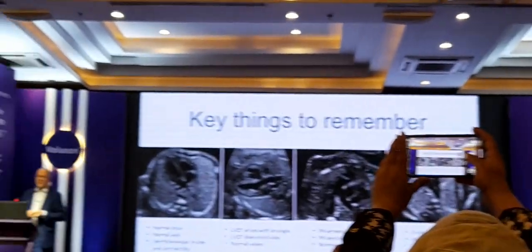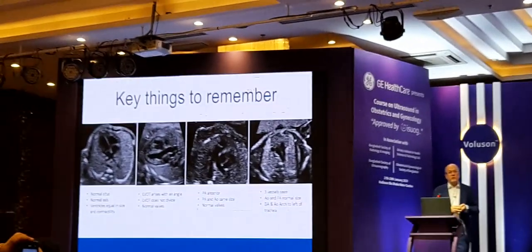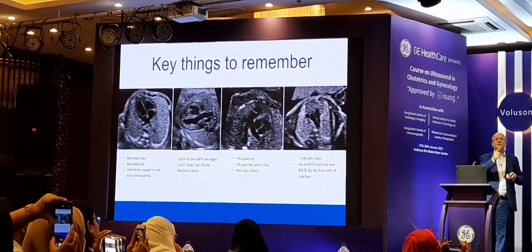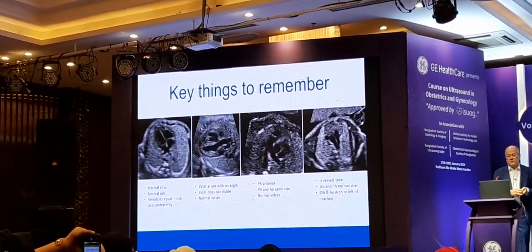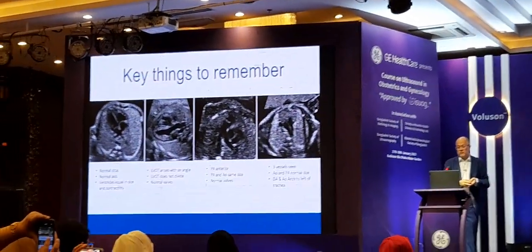And always look at the three vessel view. This is a key view. If I could choose one other view other than the four-chamber view to look at, it would be the three vessel view, because it's such an important view.